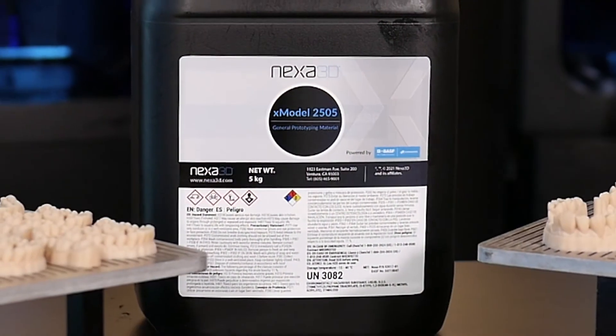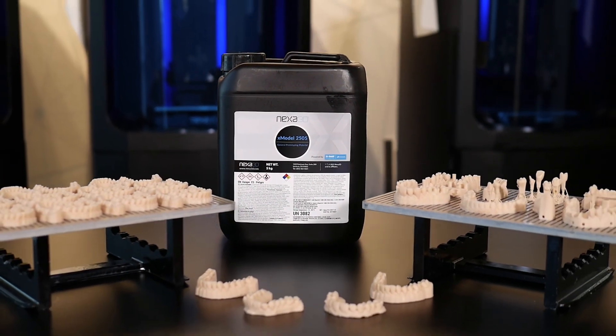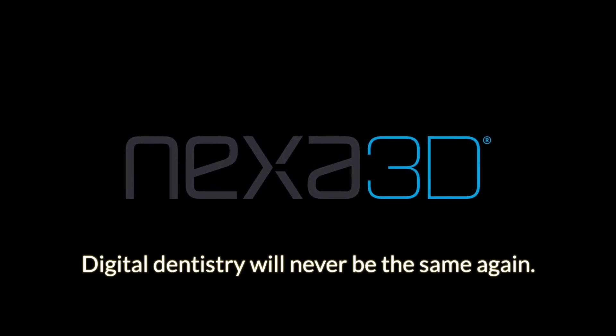how you can upgrade your dental business with the NX-D200 and X-Model 2505 modeling material. Nexa 3D — digital dentistry will never be the same again.